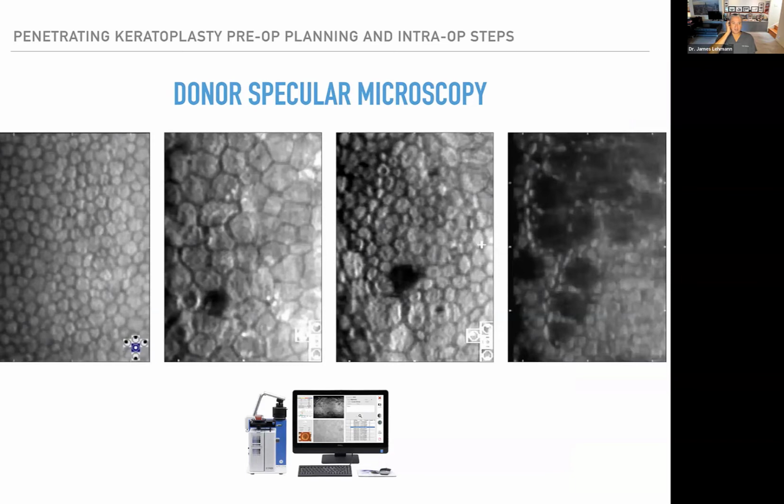This is critical. And you want the picture obviously there on the left. The one on the right would have a lot of cell dropout. You can look for stress lines from being a little too aggressive with the tissue. And you just want to make sure the cells are homogeneous, uniform, and small, and you're going to have more success with that cornea.